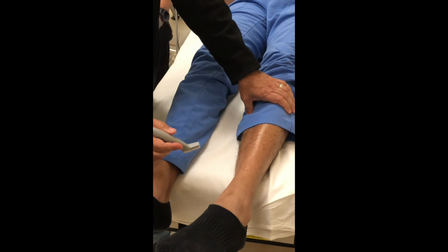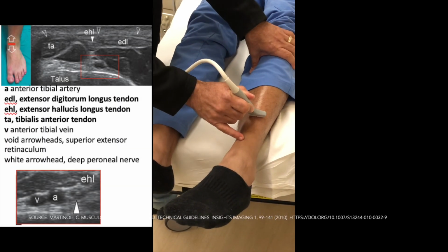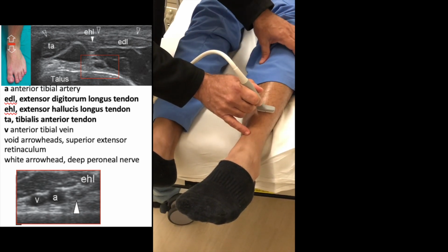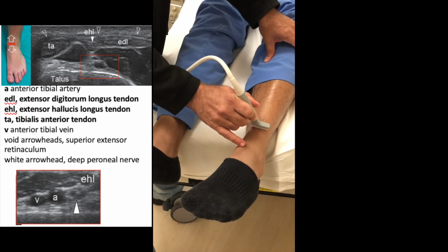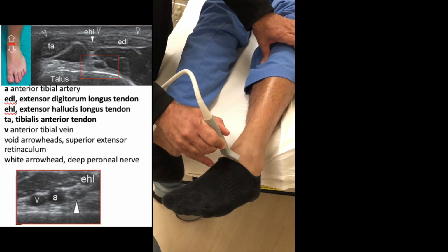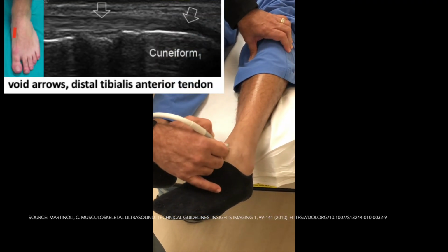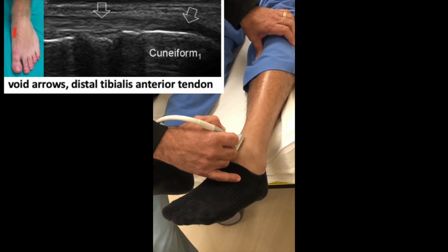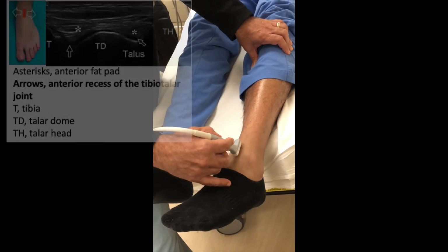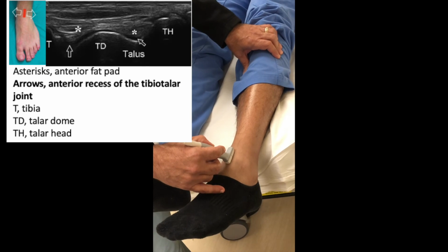The third part is evaluation of the anterior aspect of the ankle. We will begin by placing the transducer in short axis to the anterior extensor tendons, and we will follow each tendon, including the tibialis anterior, extensor hallucis longus, and extensor digitorum longus, both in short axis and also in long axis. We will also evaluate the dorsalis pedis artery and peroneal nerves, and the anterior recess of the tibiotalar joint, looking for a tibiotalar effusion.